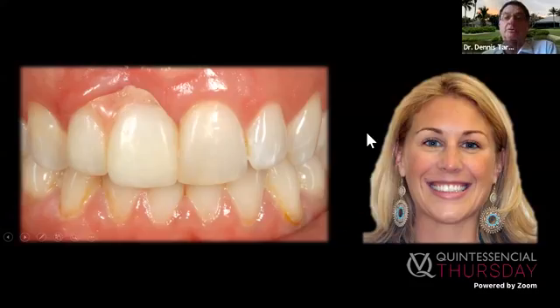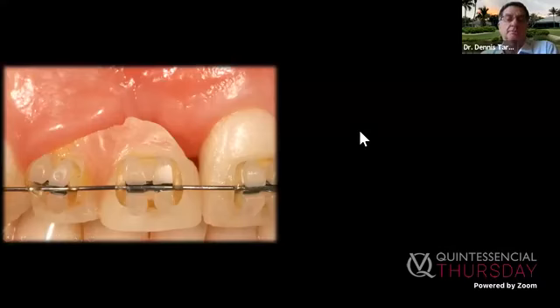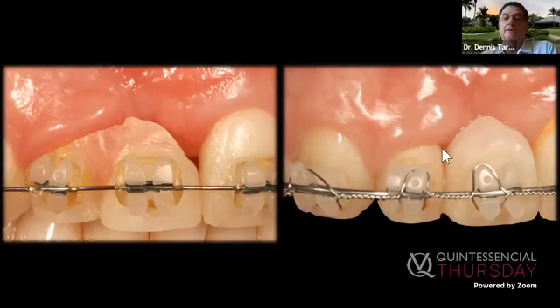So what you see, we have a big smile. Look, she shows everything. What you see here is the orthodontics. We bring it down. I'm not going to go through this at length now. You shorten it, keep shortening it, bring it down. And when do you stop? Now the distal is going to be too much tissue because that was healthy. But the mesial, you bring it down to about the same point as the adjacent healthy tissue right here. This was up here, now we brought it down to here, and that's what we want. Then we can place the implant.